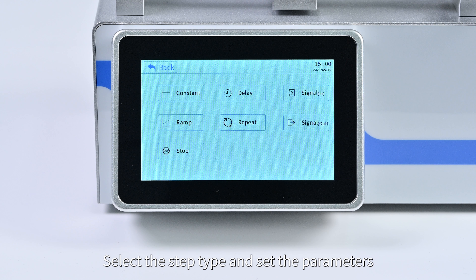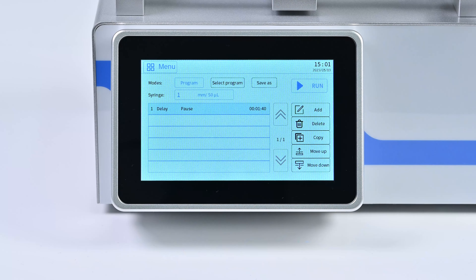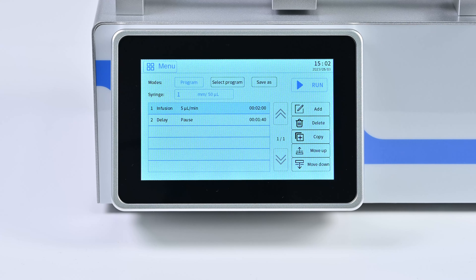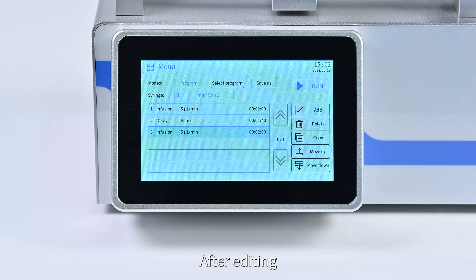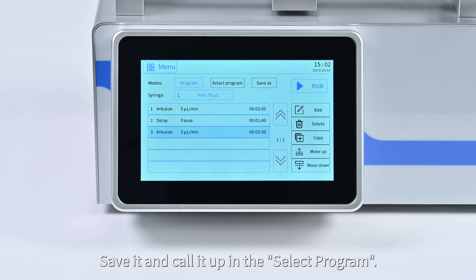Select a step type and set the parameters. After setting, click 'Back' to return to the program screen. Click 'Move Up' or 'Move Down' to reorder steps. Click 'Copy' to copy steps. After editing, click 'Save As' to save the program to the device. It can then be recalled in 'Select Program'.